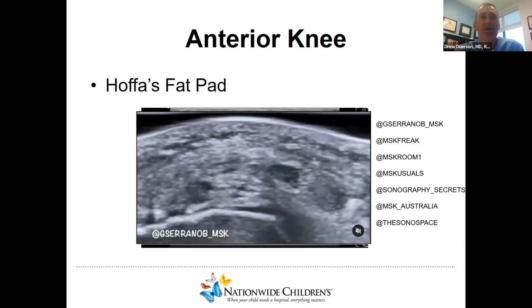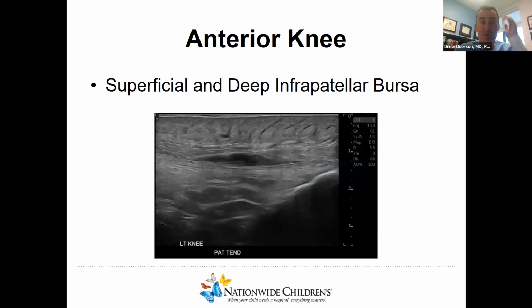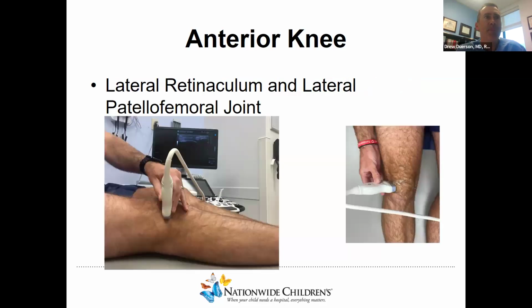And now back to our case to finish out the infrapatellar structures. We go quickly back to that potential infrapatellar bursa that we touched on, and this is where I'll be interested to hear maybe some comments from the audience to see what their thoughts are. I personally can say over the last decade of scanning in my pediatric population, I've not seen much, if any, superficial bursal fluid. So I'll be interested to hear what people think of this.